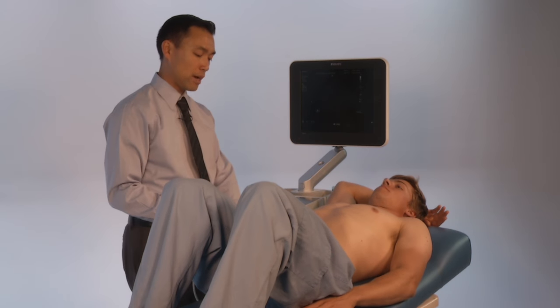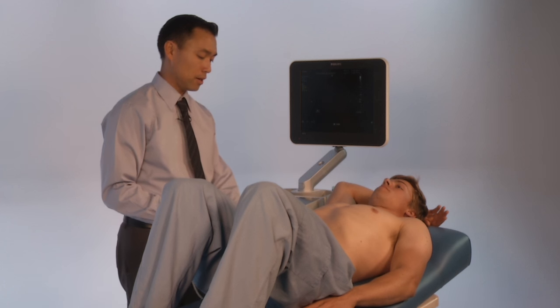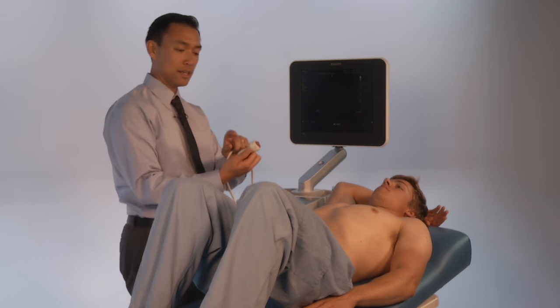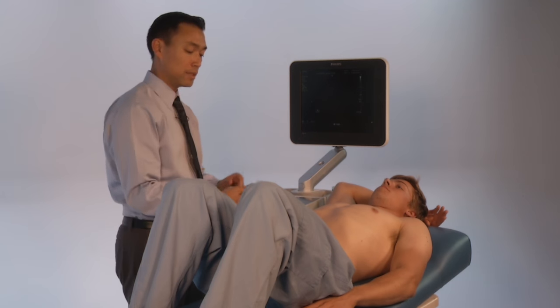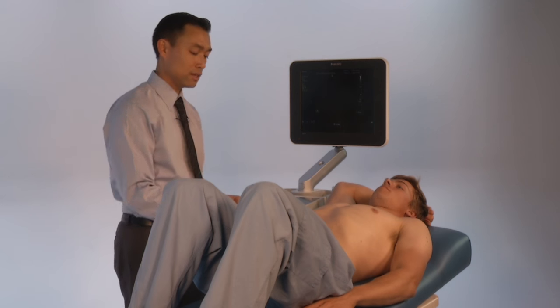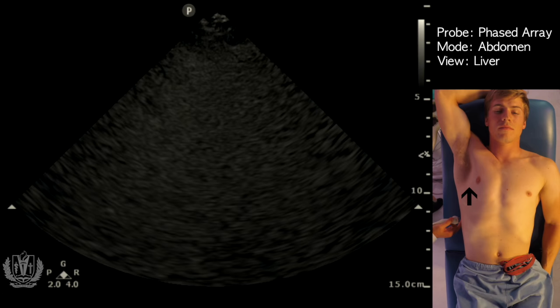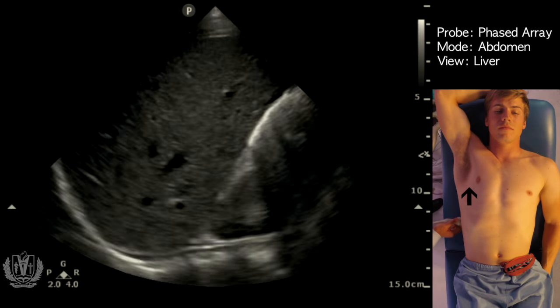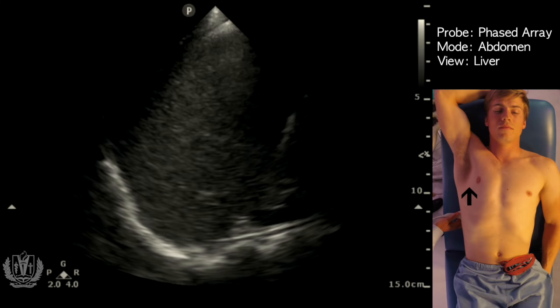You want to start around the 9th or 10th rib space in the mid-axillary line. The indicator of a phased array probe or a curvilinear probe is going to be towards the patient's head, and this is going to be in the standard ultrasound setting, so the indicator on the screen is on the left side. Here I'm going to place the probe on the patient's 9th or 10th intercostal space, looking for the liver.